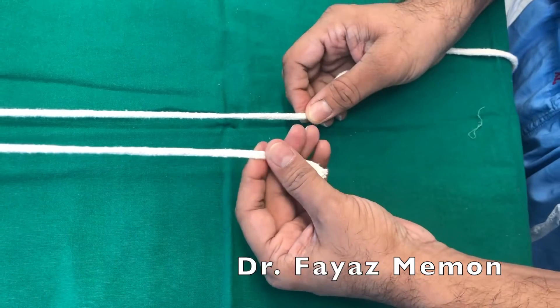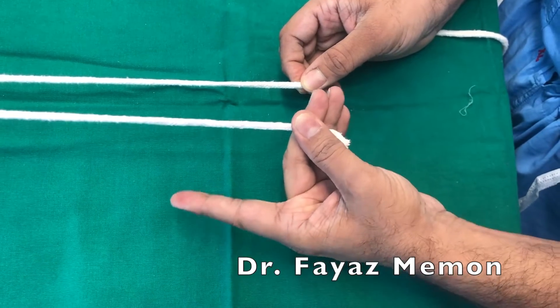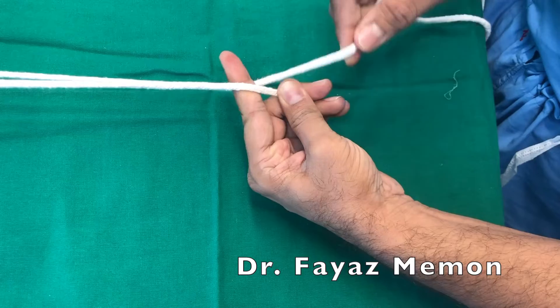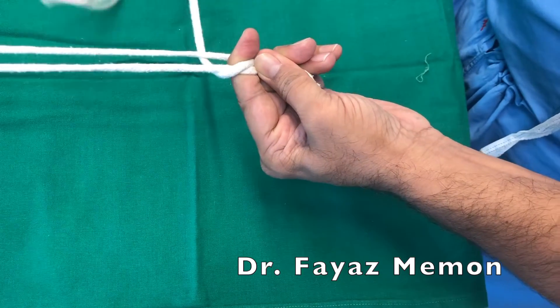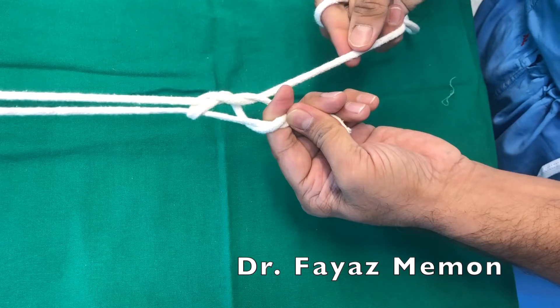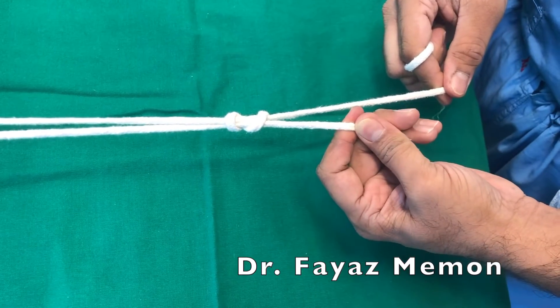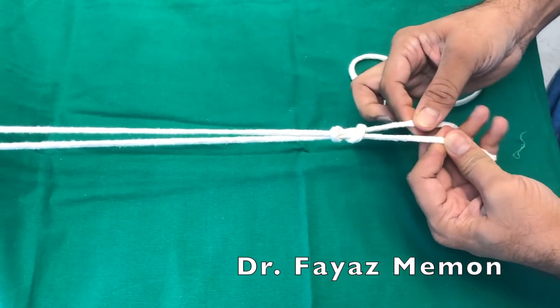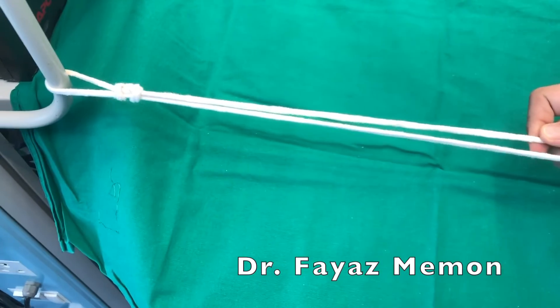When this is the post I make it smaller, because this is the one thread which I am going to pull. I hold the post in my thumb and middle finger and keep my index finger below the post. Now I am going to turn this thread over my finger and put one through the second one, and the third one goes through this. Once I do this I remove my finger and slightly tighten it. In a sliding knot we don't push the knot — we actually pull the post, so when I pull the post the knot automatically goes and secures there.